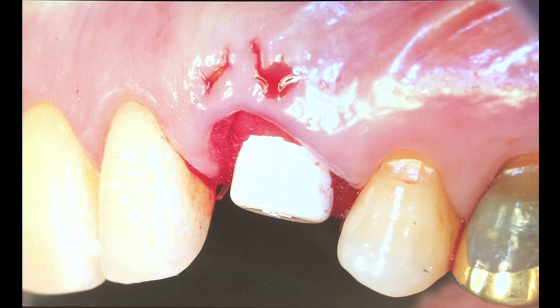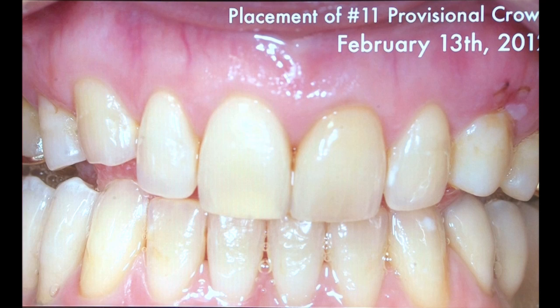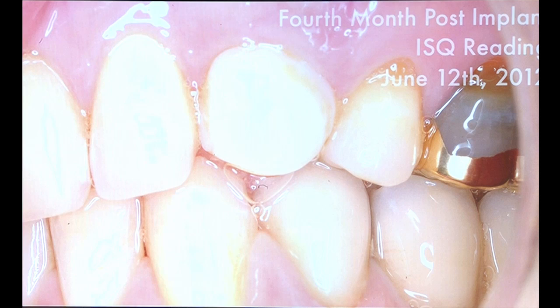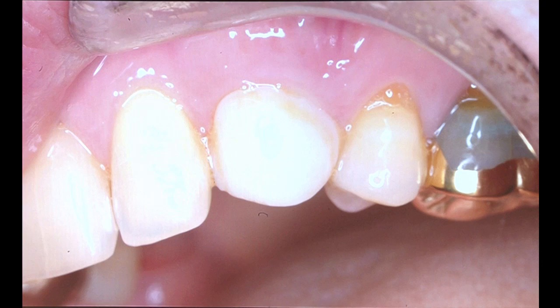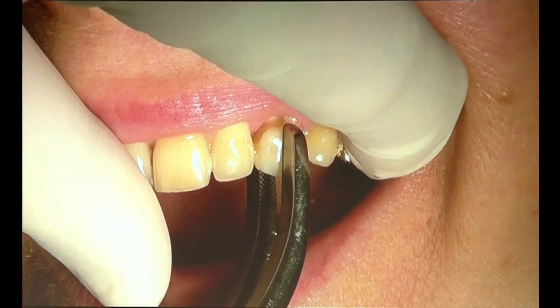So now you can see the contours and marginal adaptation of the gingival tissue around that implant that is just placed and the effect of the augmentation. This was a patient 1 week later for follow-up, and you can see the healing progress is undisturbed and proceeding adequately. At 4 months, I'll go ahead and remove this provisional restoration and remove the abutment. Again, I feel that it's critical not to disturb this entire area as it's going through the healing process.